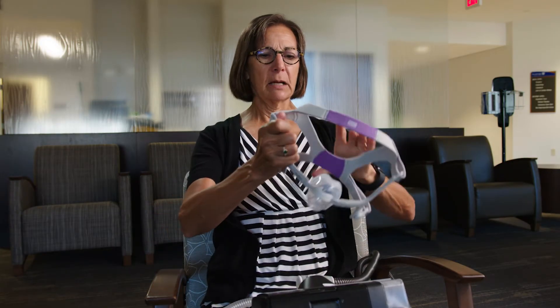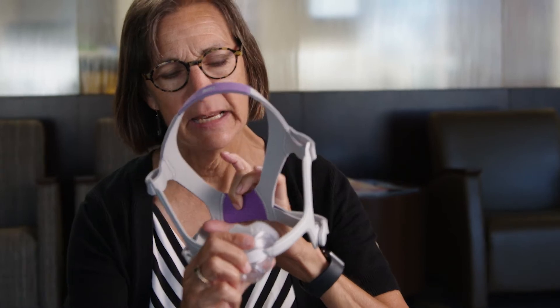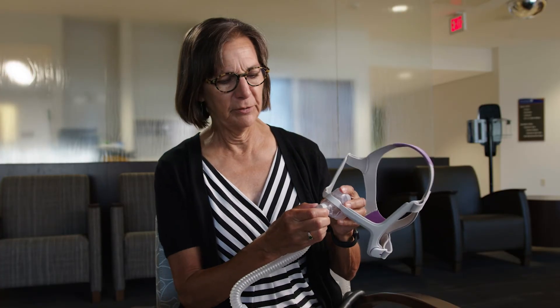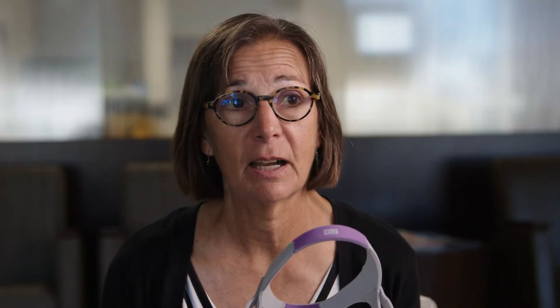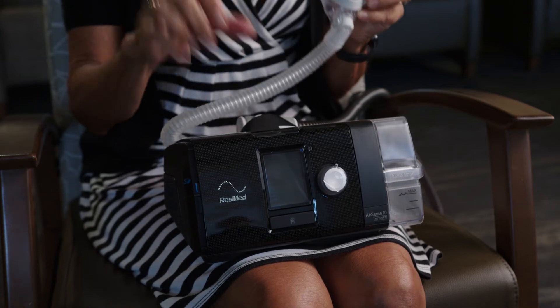And you put the mask on over your head, and mine is just a nasal mask. Then I just hook the oxygen tubing onto the front of it. So this is the process — I just click it on, you don't feel it. And it's silent, absolutely 100% silent. It doesn't have any big breathing sounds that's going to bother your partner or bother you.